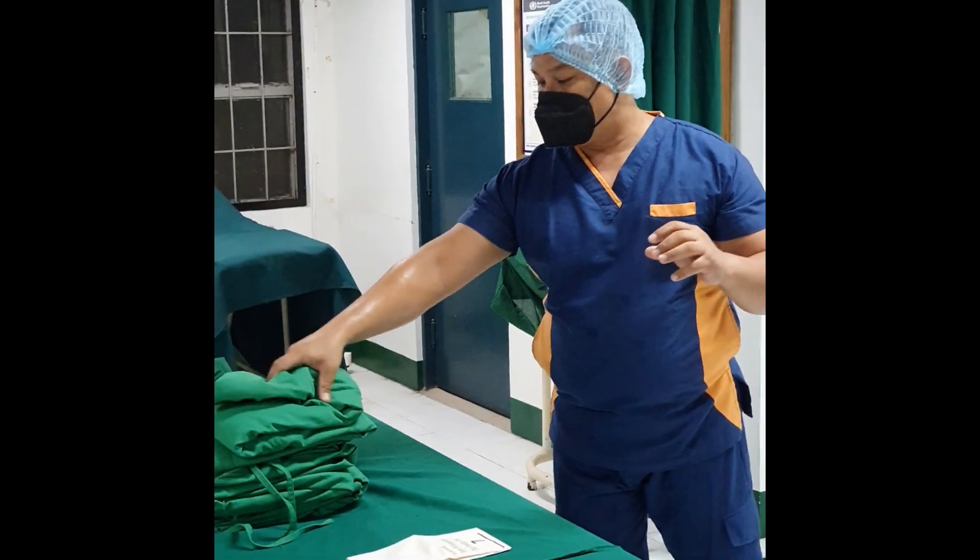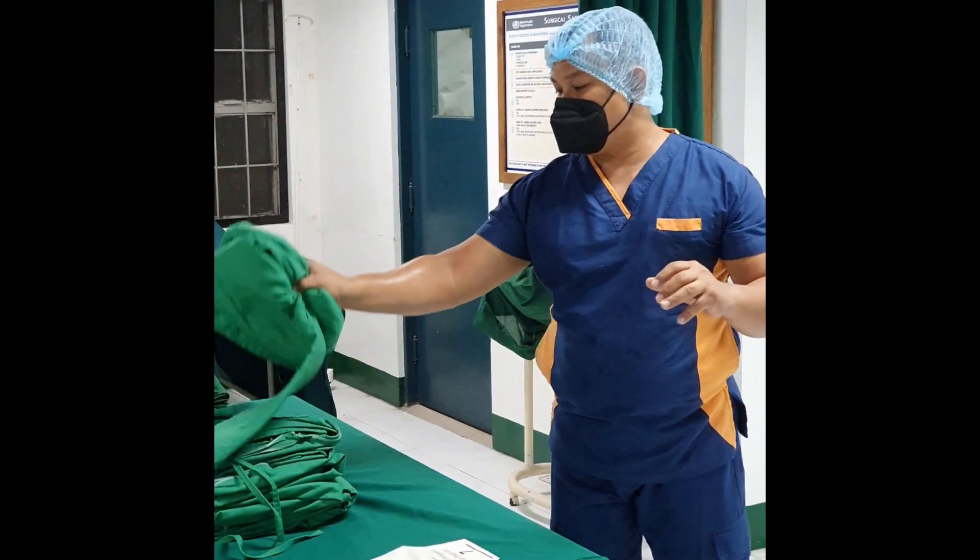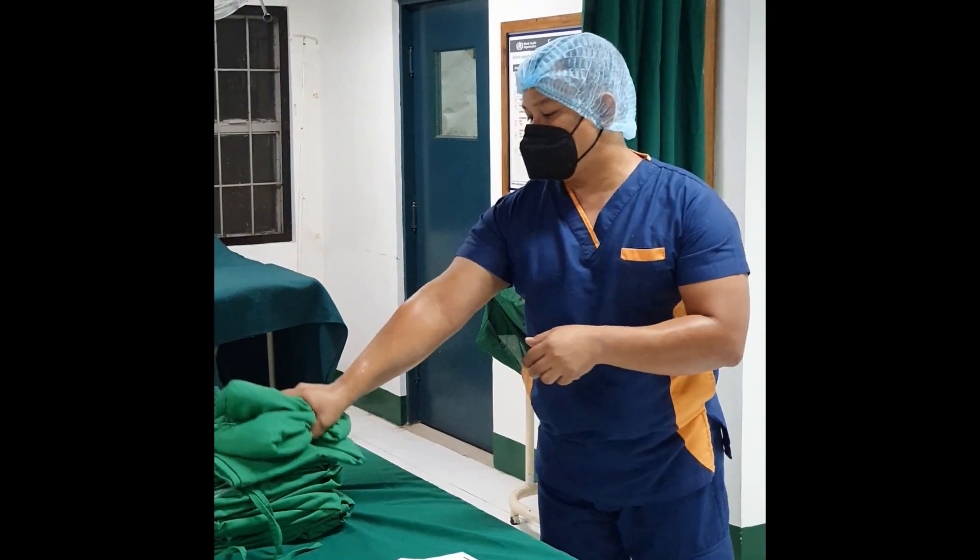Press the sterile gown at the neckline with both hands, then step back from the table.